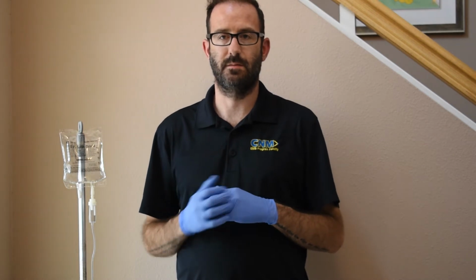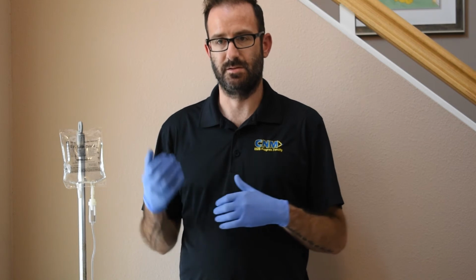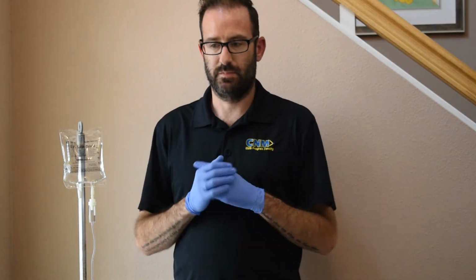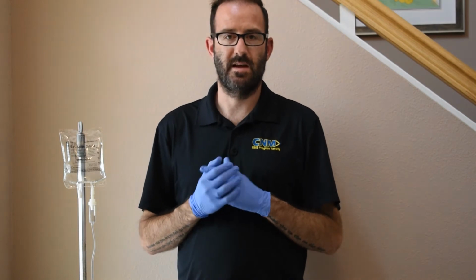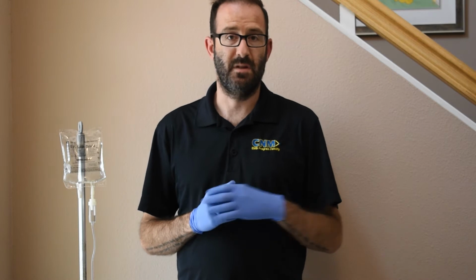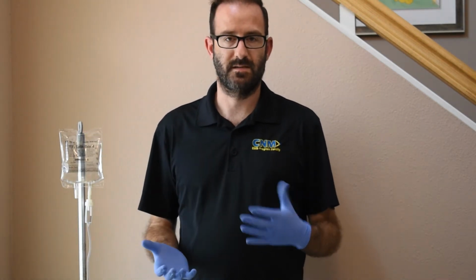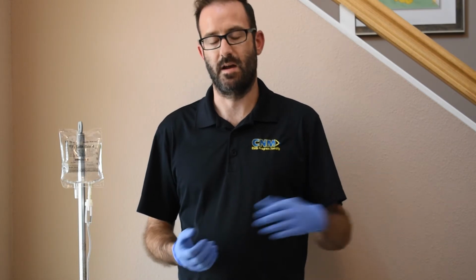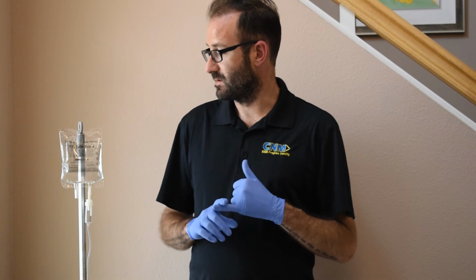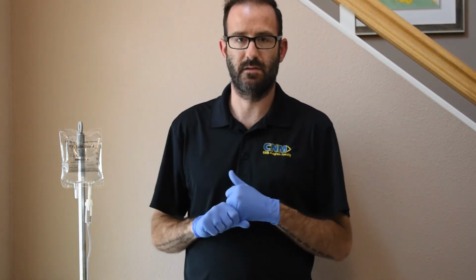We're going to use a pediatric patient today as our make-believe patient. So rather than explaining the procedure to our patient, I'm going to explain the information to the mother and let her know that the child got into grandma's stash of pain medications, overdosing on a medication, so we're going to go ahead and administer Narcan through our IV, which is going to reverse the effects of the opiate that the child ingested. So I do want to make sure that I have the correct patient, little Susie over here.